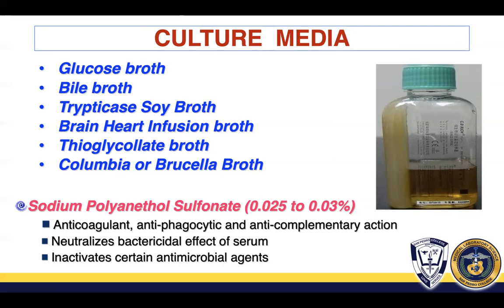Usually, these culture media would contain sodium polyanethol sulfonate. This is an additive that's usually incorporated into these culture media at a concentration of about 0.025 to 0.03%. This additive, sodium polyanethol sulfonate or SPS, has anticoagulant, antiphagocytic, and anti-complementary action.